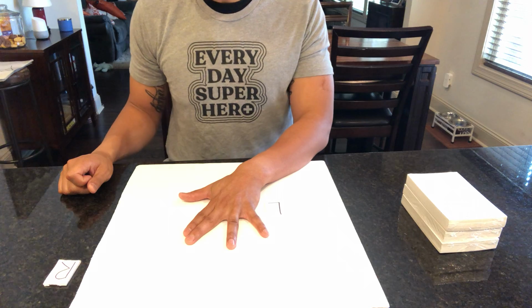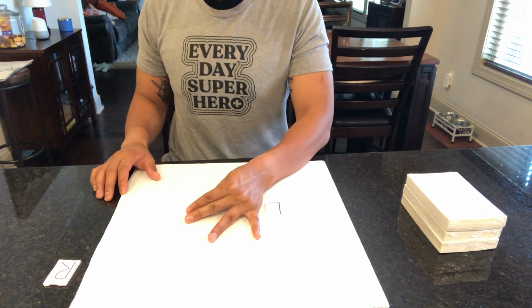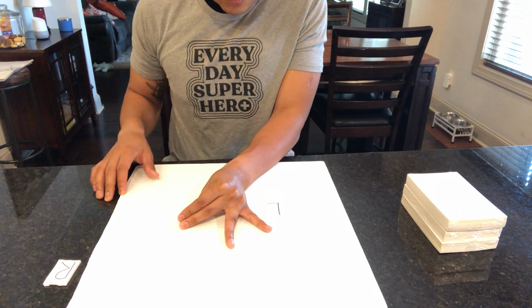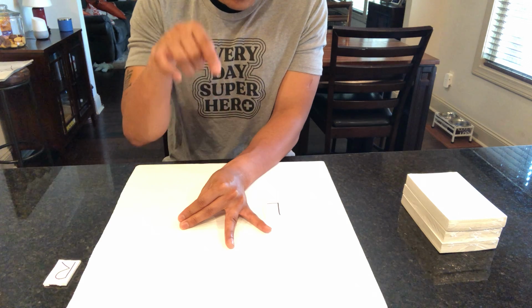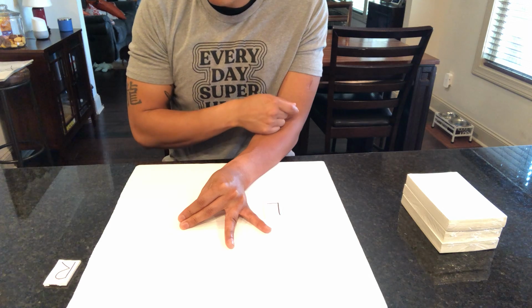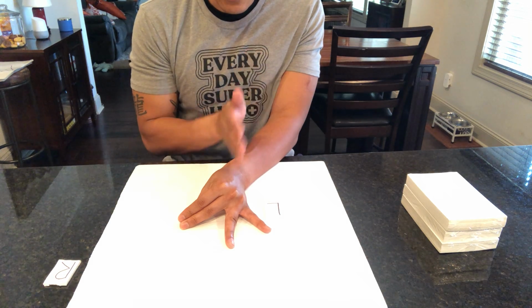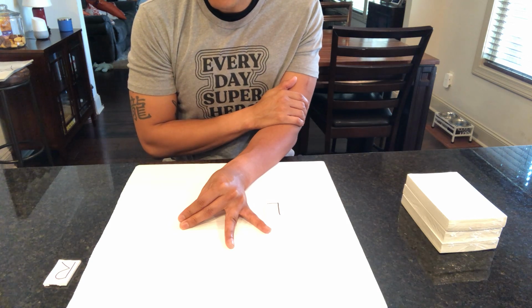Now we move over to the oblique finger projection. What I'm going to do is move the finger here. Again, 4th digit is still the affected finger. Collimation, again, isolate the finger. Central ray perpendicular to the PIP joint. Here we're looking at oblique projection of the soft bones and tissues of the affected finger. We're going to keep the finger parallel to the film plane.